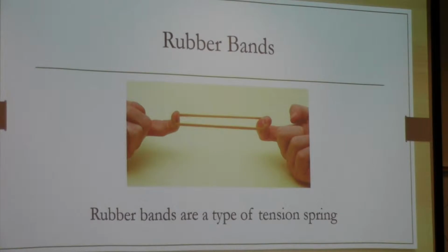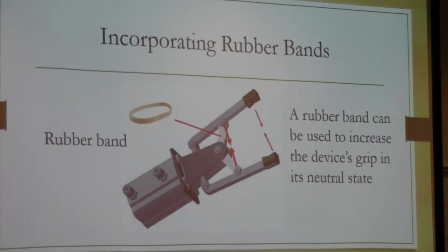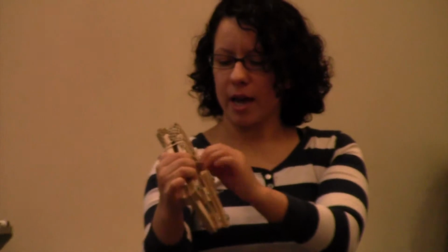And rubber bands are also really useful because they're a type of tension spring. On this example here, it's similar to this one. What I did here is this one can be removed, but you want to add it if you want to make it stronger. So if you're picking something up that doesn't require this to be so strong, you can take this off, but this is just something that makes it a little bit more flexible. So if you want to pick up something heavy, you would add this rubber band here.